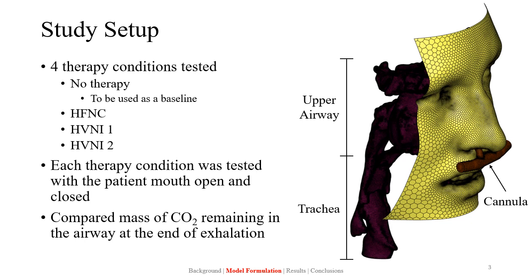The mass of CO2 remaining in the airway at the end of the exhalation process was compared to gauge CO2 flush effectiveness for each therapy. This was used as the metric for comparison because it is a strong indicator of the amount of CO2 inhaled by the patient.